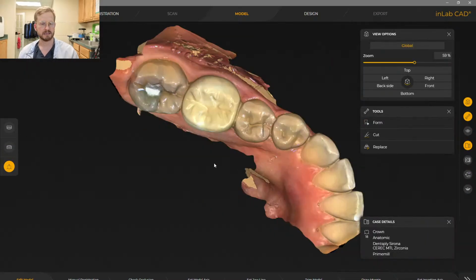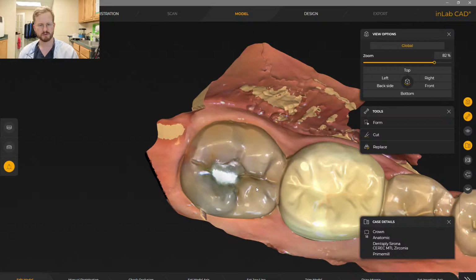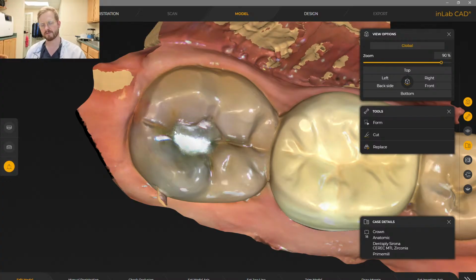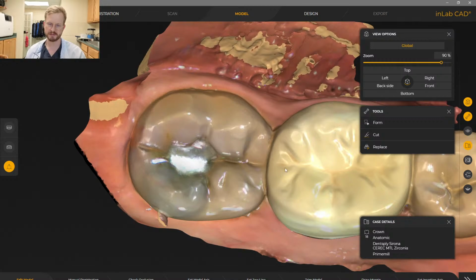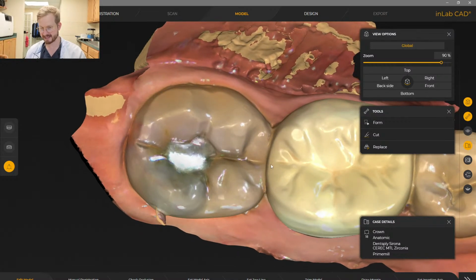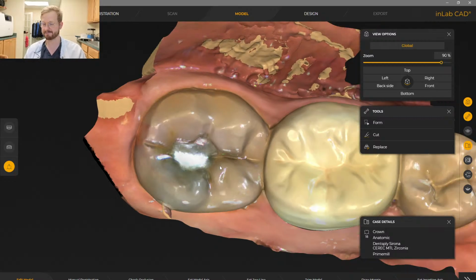As you can see in the pre-operative image, this tooth was cracked. So there's a huge crack running across the occlusal surface of that tooth. It's also uncomfortable to chew hard or crunchy food. It also fails a tooth sleuth. So these are all leading towards, hey, this tooth is cracked. You can literally see it even on the scan, and that typically doesn't happen. Even if a tooth's cracked, a lot of times you can't see it on the scan. In this case, you can.